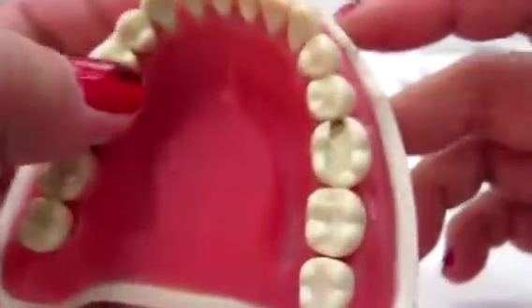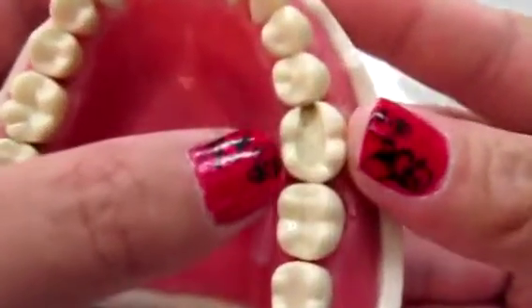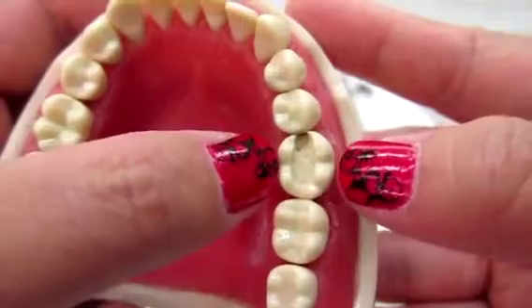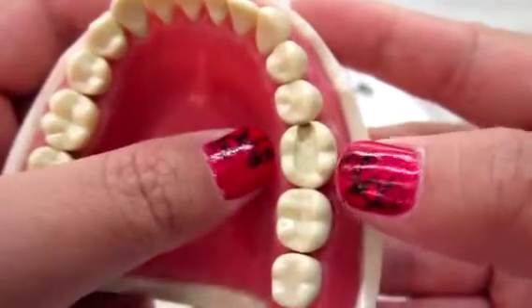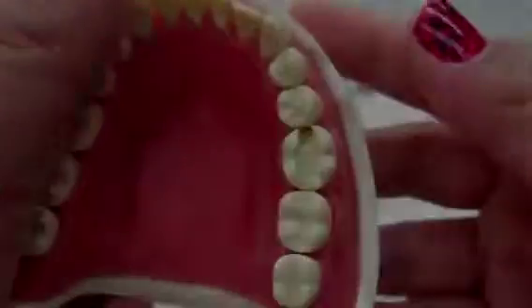And then of course you're going to need your typodont. Right now we're going to be filling number 30. And if you notice, it's a very, very big wide prep. Because if you are able to fill an amalgam into this wide prep, you can do it on any kind of prep.